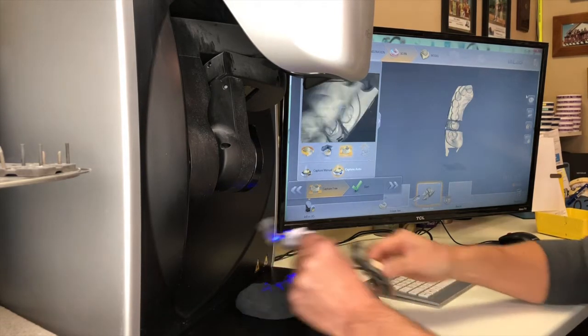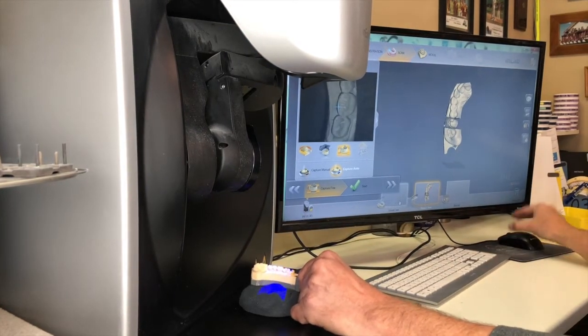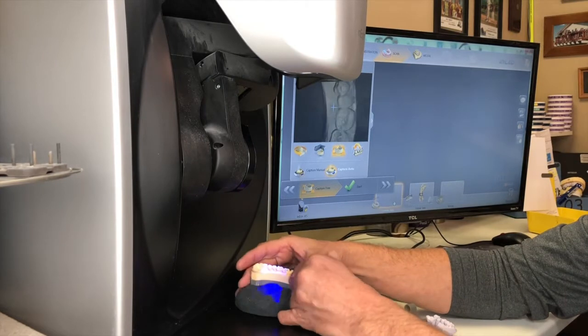Then as long as I keep moving under the light, I can change models. I go over here and select the lower model, and again I will take just four shots of the lower model.